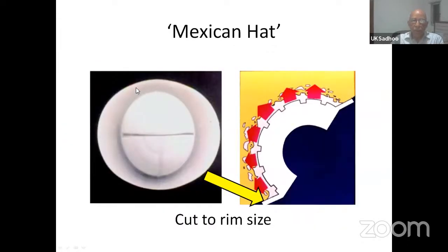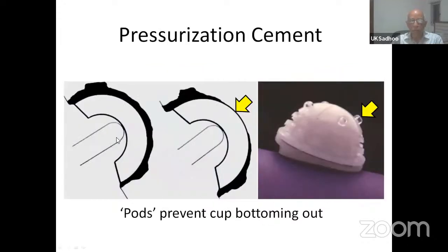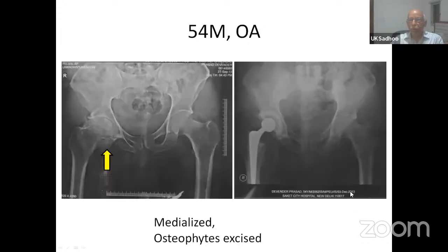So this is that so-called Mexican hat or the rim, which can be cut to size to fit the native acetabulum according to a template. And it stops the cement escaping when you are pushing the cup in medially. Now, if you were to push the cup without either the rim or anything else in between, it will bottom out. To stop that bottoming out, you put these pods, PMMA pods, on the surface of the cup, which will ensure that a certain amount of the cement is still remaining after your pushing. Now we'll go over some examples.